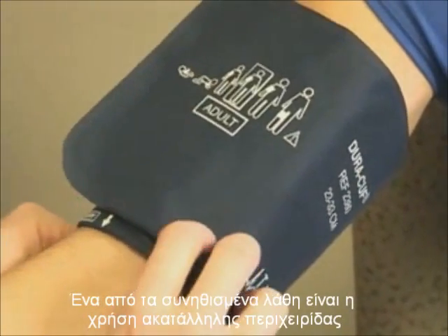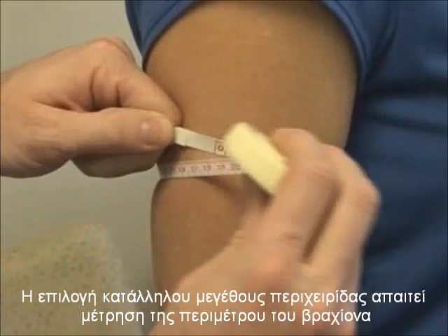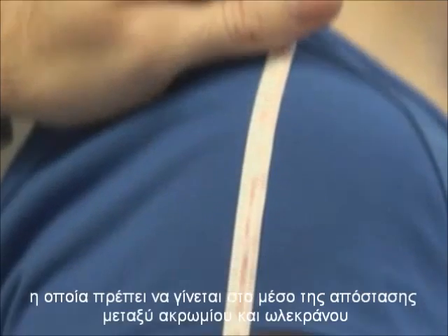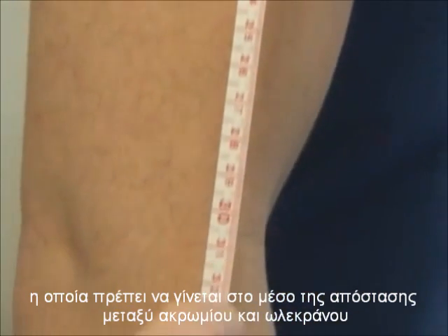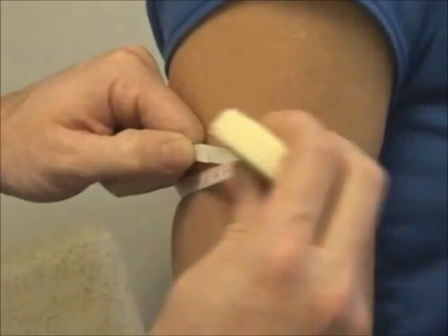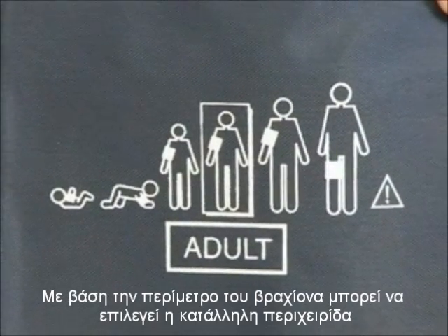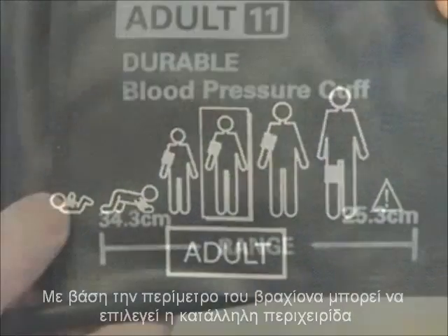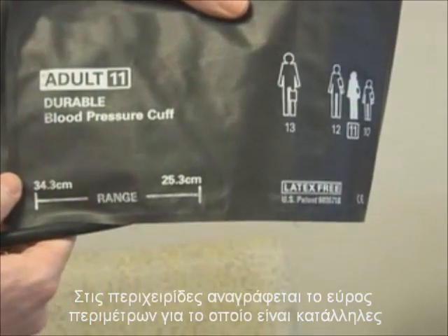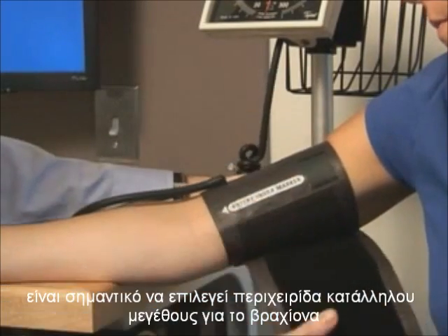A common error in taking blood pressure is the use of an improperly fitted cuff. Selection of an appropriately sized cuff requires assessment of the arm circumference. The midpoint position is determined by measuring the distance between the olecranon and acromion processes. The arm circumference is then measured at the midpoint. Once the arm circumference has been determined, the appropriate size cuff can be selected. Cuffs typically are marked with acceptable sizing indicators to facilitate proper fitting. However, it is more important to use a cuff that is appropriately sized for the arm.